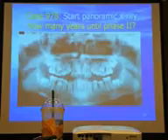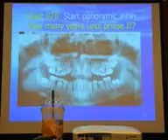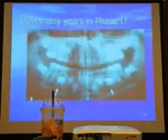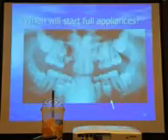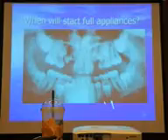That was what we saw in Rebecca's case. Now, when we check her, we're going to say that she has 6 months to full eruption. So again, here almost 4 years, crown only with a tiny little root, and here about 2 years because this is 1/2 of the root.